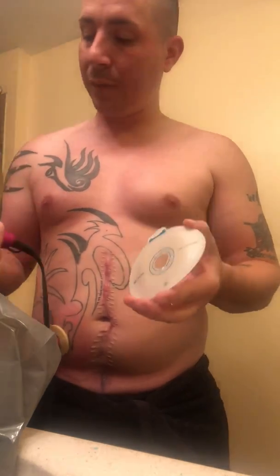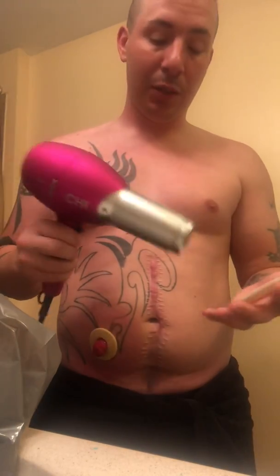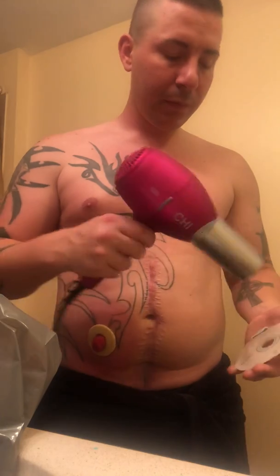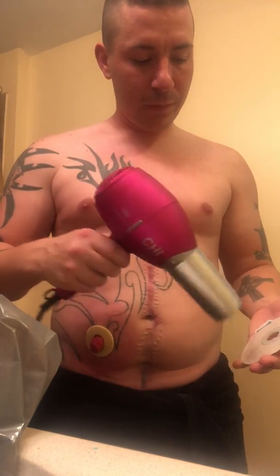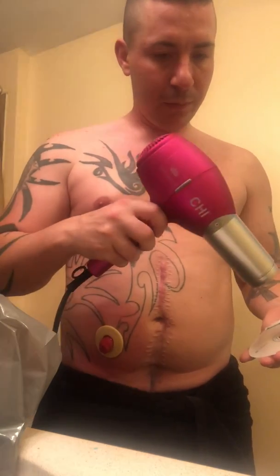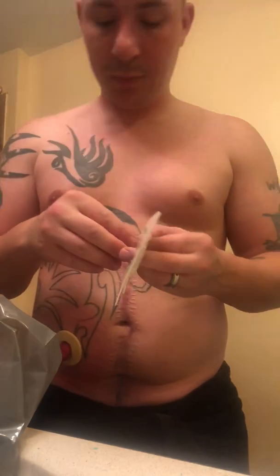So, little trick. You got your barrier. I always cut mine before I shower. But I am going to heat it with the blow dryer to get the glue just a little bit warm so we get a better stick once we put it on. All right, not too long. You don't want to melt it. You just want to heat it up.